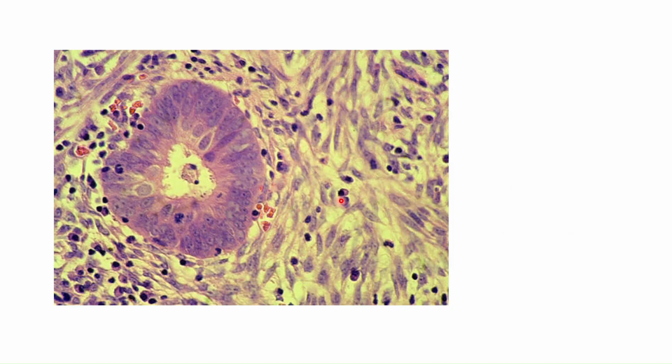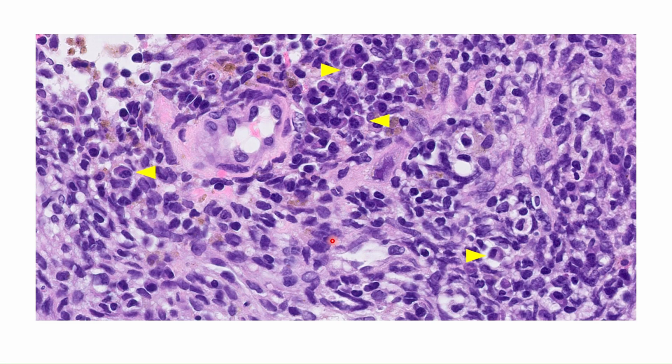Here we can see the same in high power view. These are the plasma cells with eccentric nuclei, perinuclear halo, and abundant cytoplasm. So, presence of plasma cells indicates chronic endometritis. Here again, this yellow arrowhead shows plenty of plasma cells, some hemosiderin pigment due to internal bleeding or abnormal uterine bleeding because of endometritis.